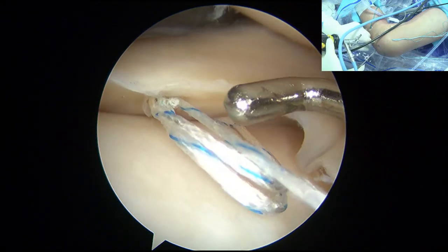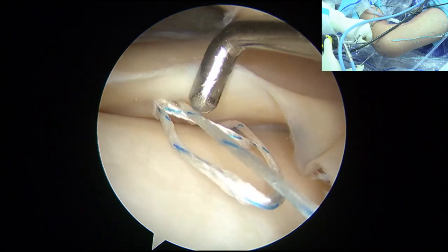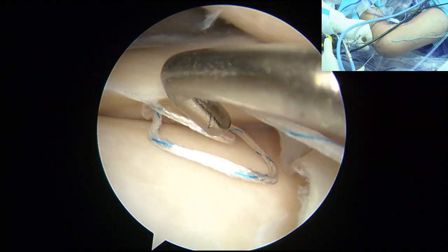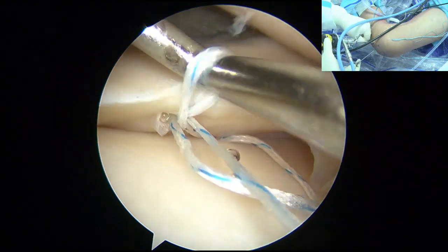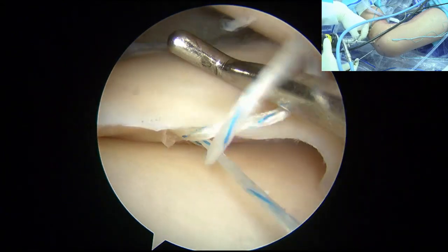If you only repair one surface, the meniscus will be flipped, okay? 上下表面要都缝到，不然只缝单面，它就会卷上去。This is the leading sutures. Right, you find the leading sutures, this one, right? This one, okay? You pull this one. Okay. So you will slowly get in like that. Okay.